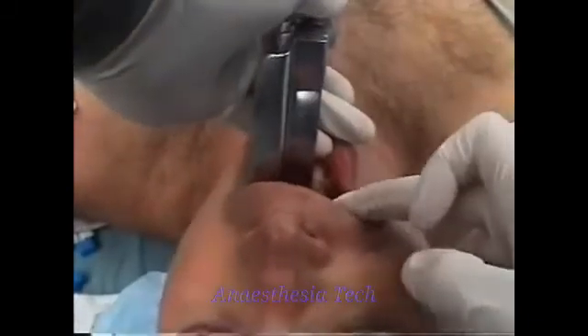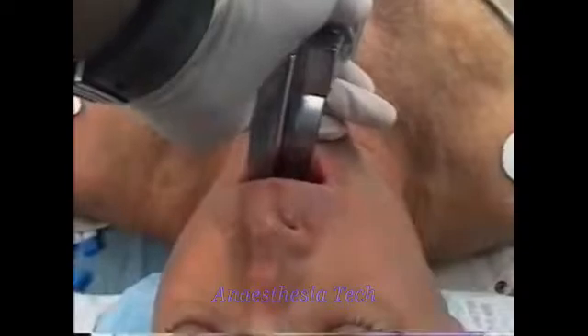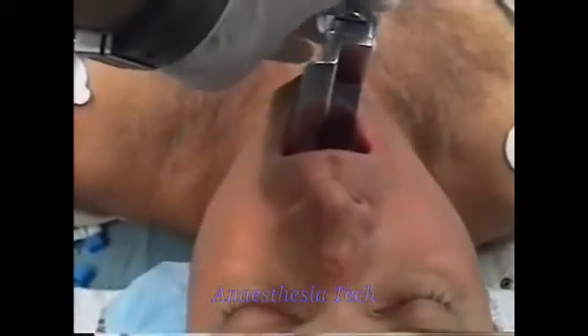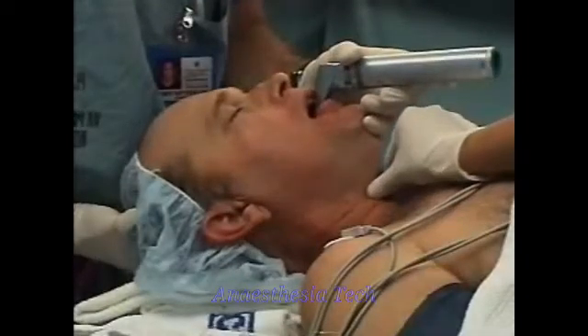Insert the blade on the right side of the tongue, displacing the tongue towards the left. An assistant can retract the right side of the mouth and improve visualization. Cricoid pressure sometimes brings the larynx into better view.